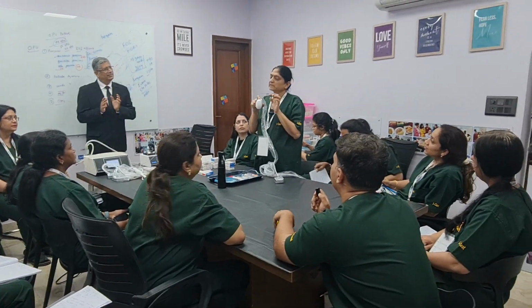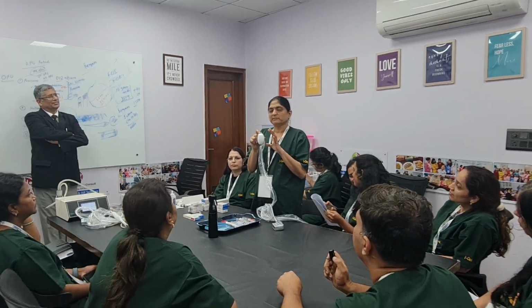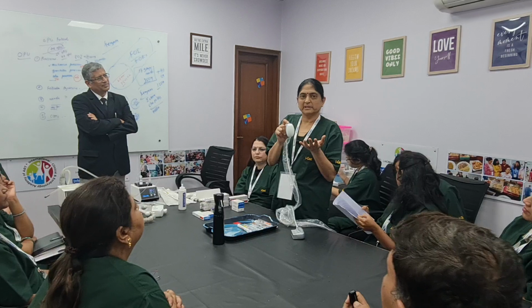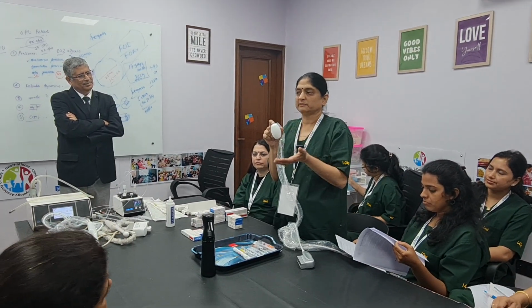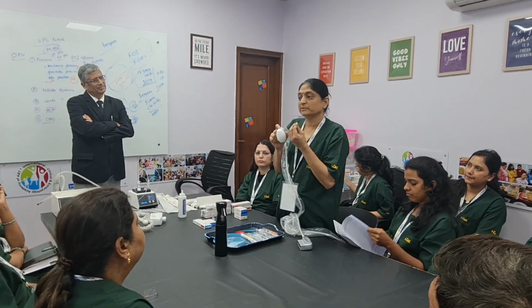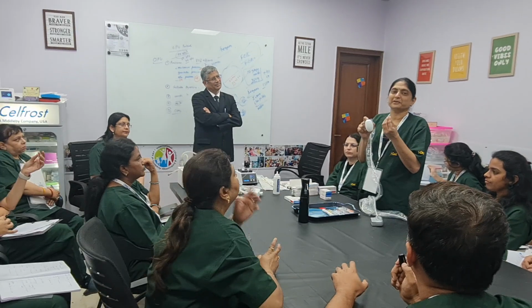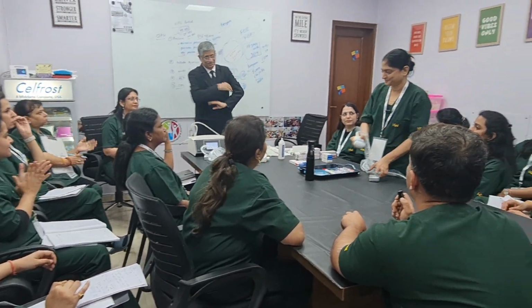Another thing I forgot to tell is, whenever you're doing an abdominal ultrasound of the lower abdomen, it has to be with a full bladder, because we need to delineate the uterus and ovary. Otherwise, from the abdominal wall, we will not be able to delineate where it is from. But it's exactly opposite in TVS, where you should not have a full bladder, or then you'll not be able to see. The proximity is much better in TVS. Thank you.